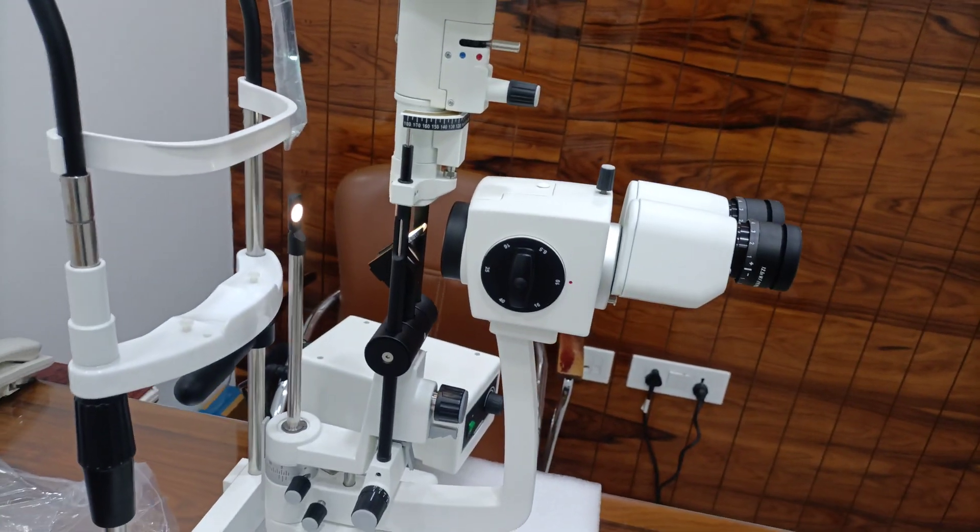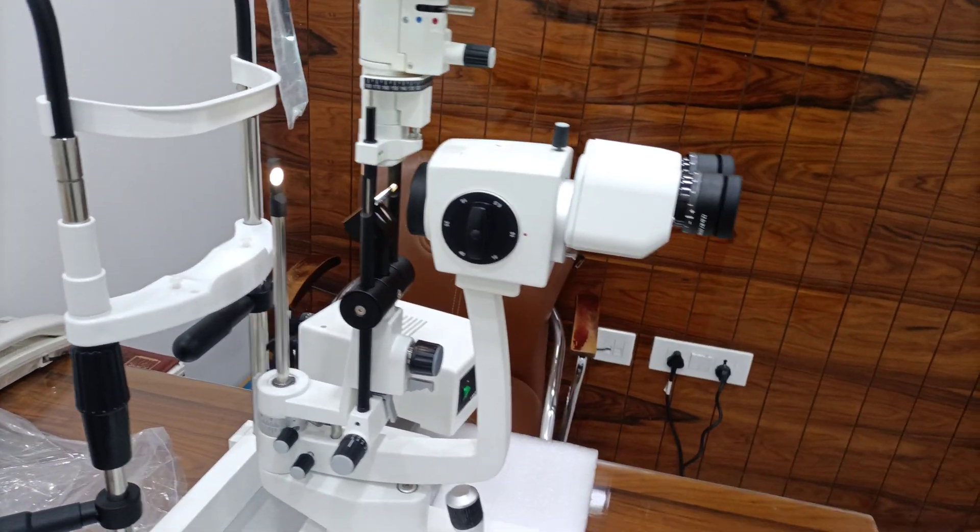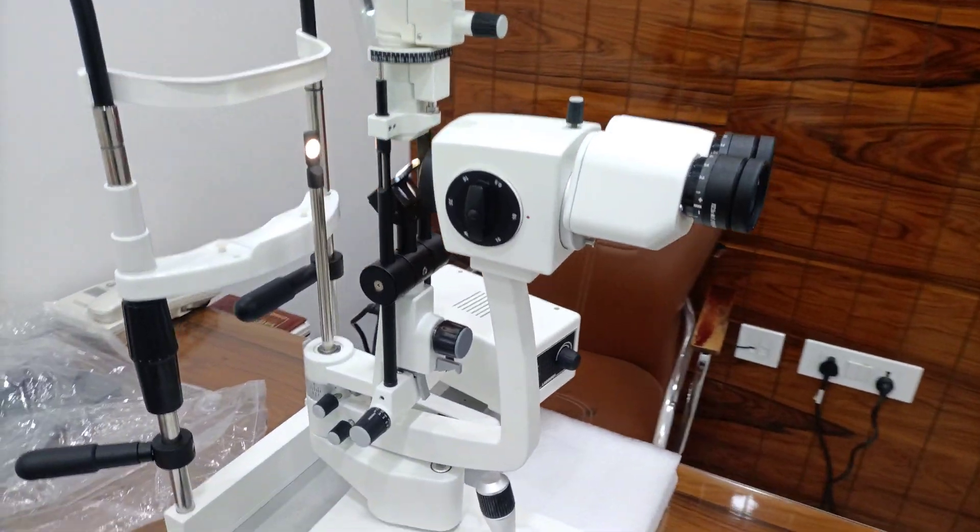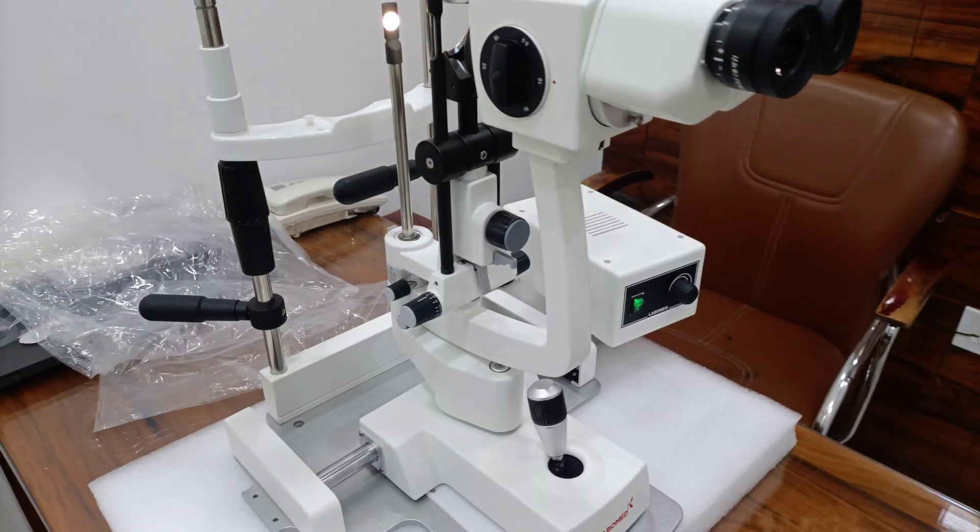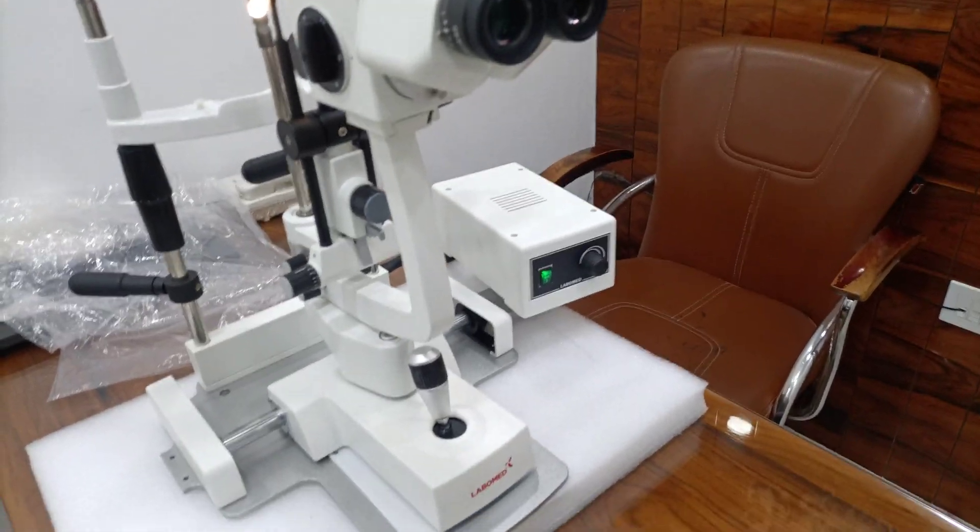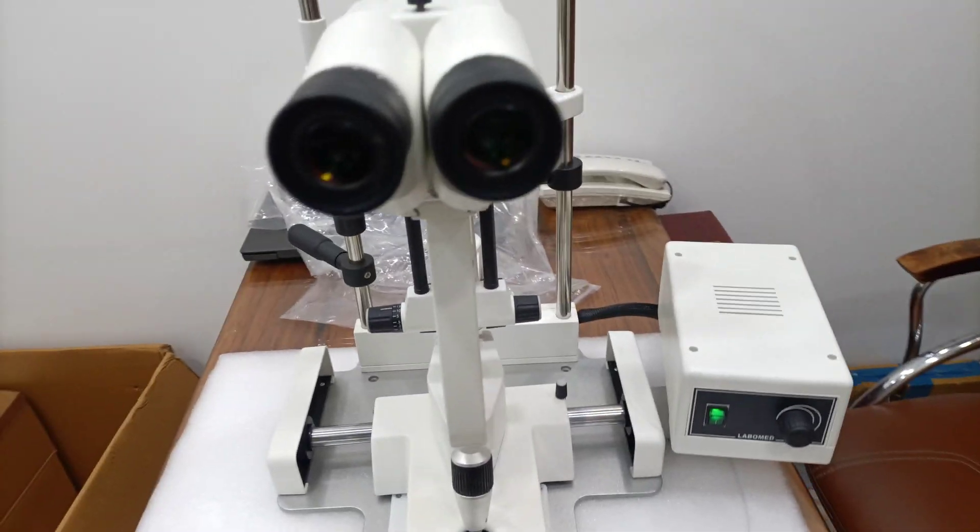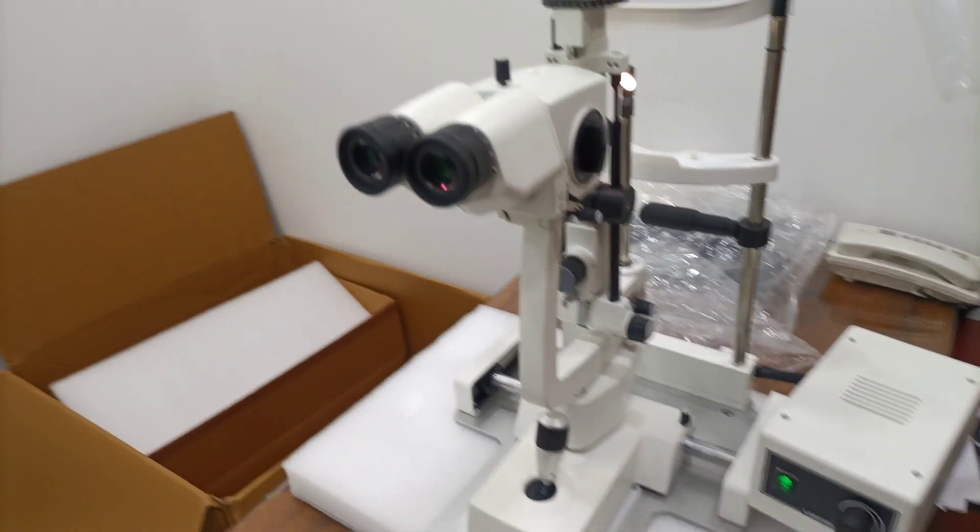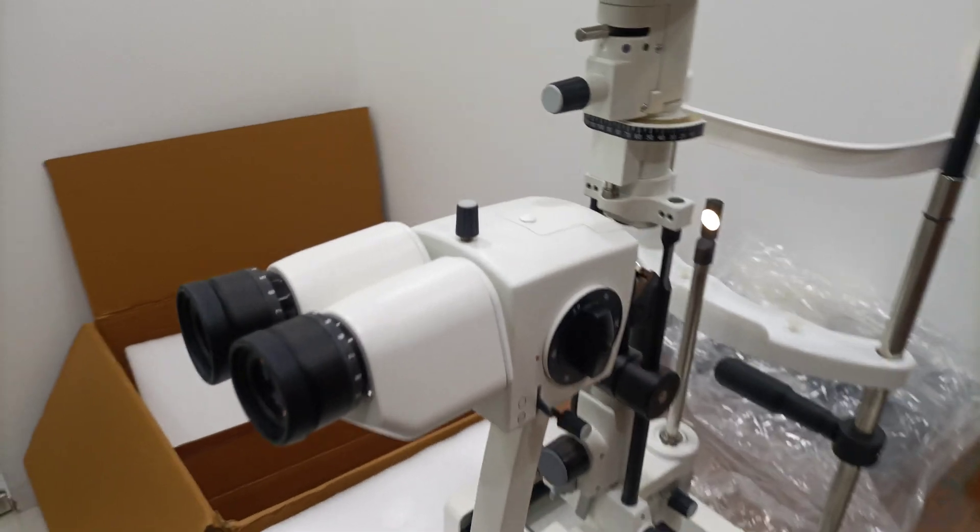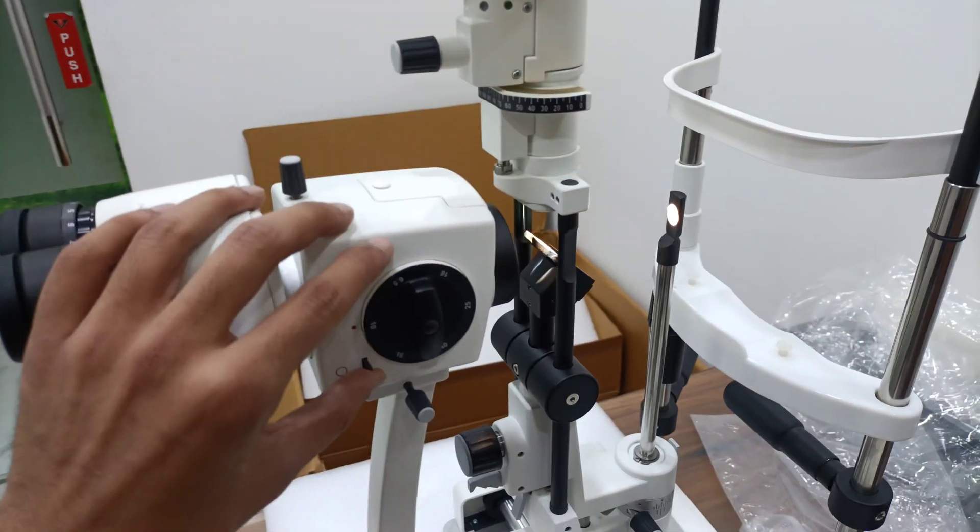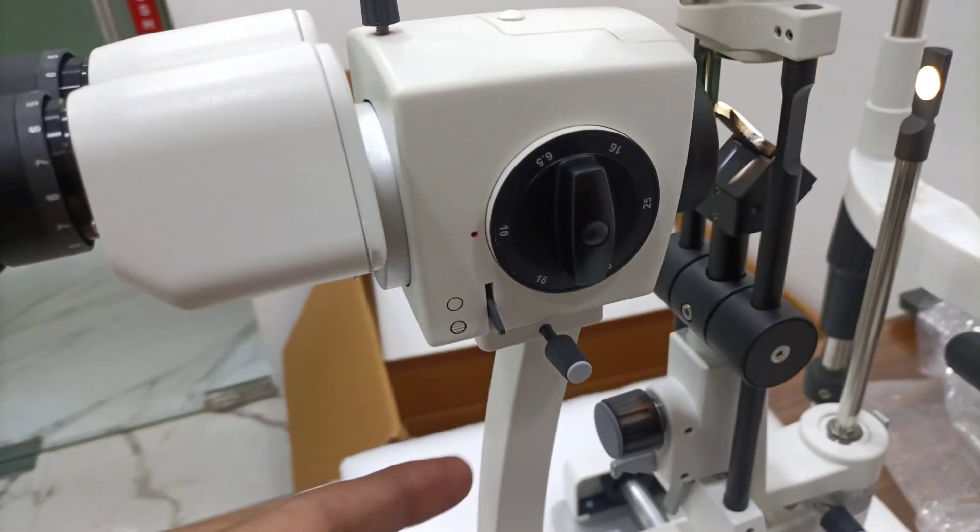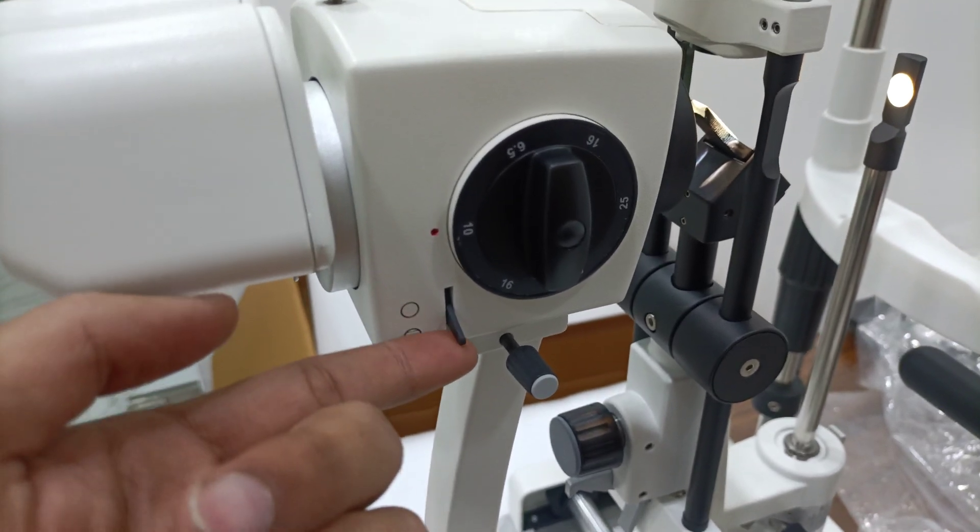So it is slit lamp, Labomate, five-step magnification, EVO 450. It is yellow filter.